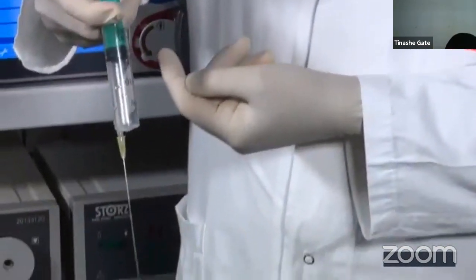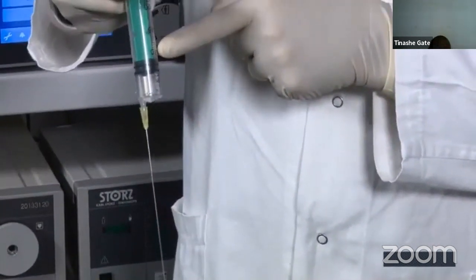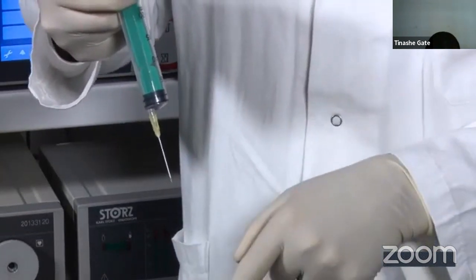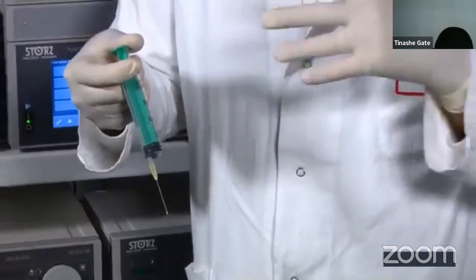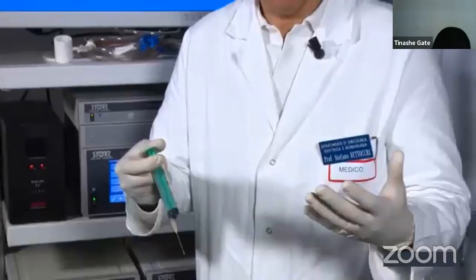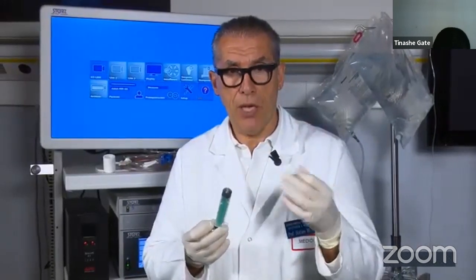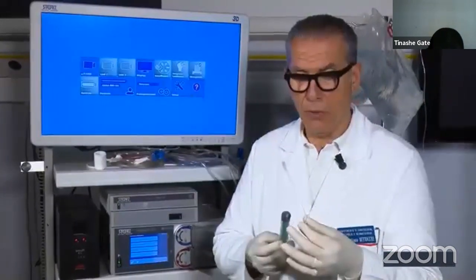And you see, I need a lot of force and a lot of time to empty the syringe. Also, if you observe the flow coming out from the tip, together with the flow coming out from the previous one, there are two different amounts of liquid. So what we have done is reduce the caliber of the output channel from the large one to the thin one, and everything changed in terms of pressure, in terms of flow, and in terms of the amount of liquid coming out.